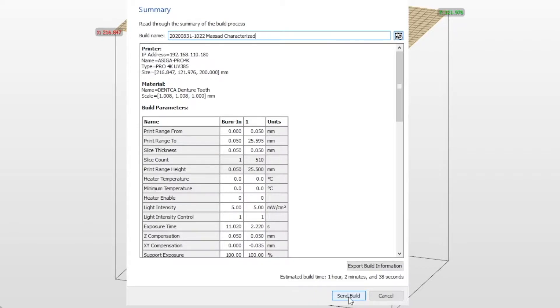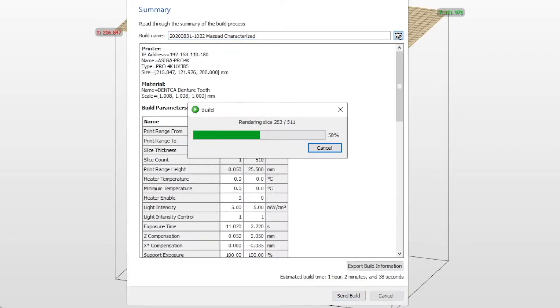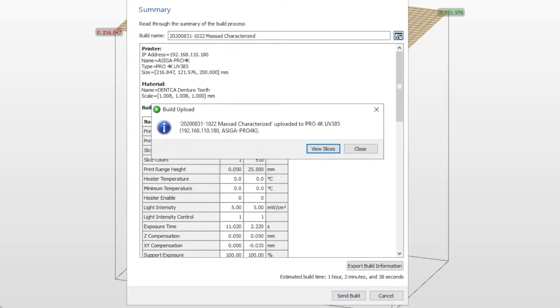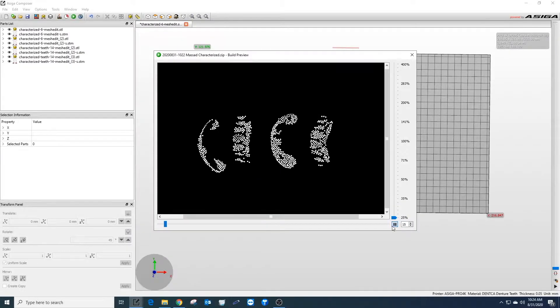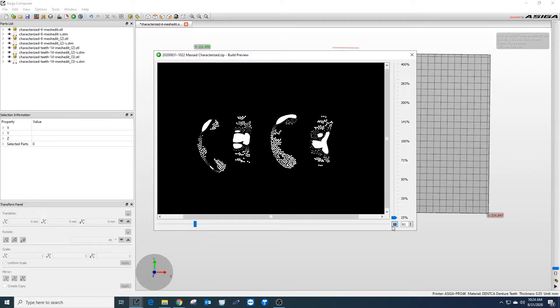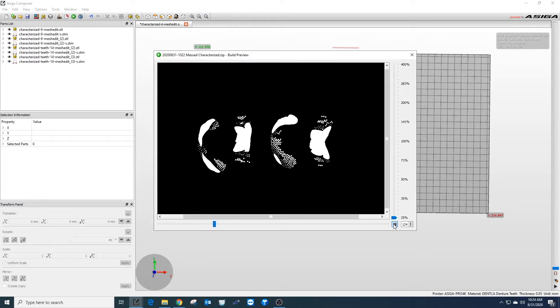Once the build is finished being sent to the printer, select view slices. Here you can view the layers being sent to the printer and ensure nothing is missing and no mistakes have been made in designing the teeth for characterization.